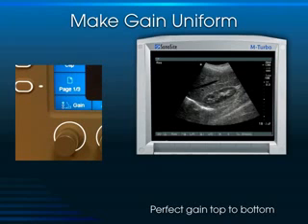And this very hyperechoic structure, anybody know what that is? That's the diaphragm. I hear people whispering. Very good. There's the diaphragm right there. So if I had to rank everything on the screen in terms of their levels of echogenicity, and that's a fun question of mine to ask, rank the following in terms of their echogenicity. Number 1 would be the diaphragm. Number 2 would be the renal sinus. Number 3 would be the liver. Number 4 would be the renal cortex. And then number 5, the least echogenic structure, would be the hepatic vein. Make sense? I'm just trying to get you to think about some of the art of this. We're going to move on now.